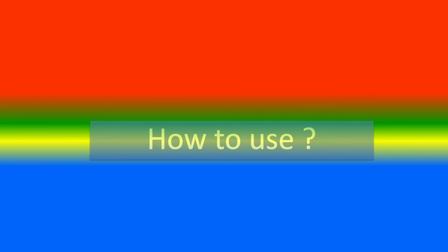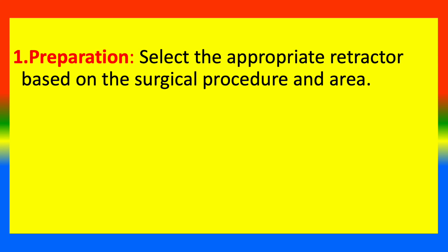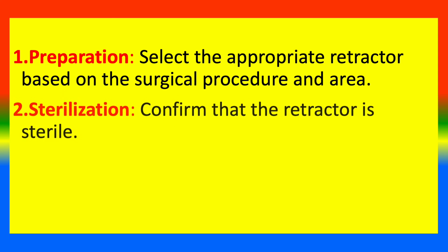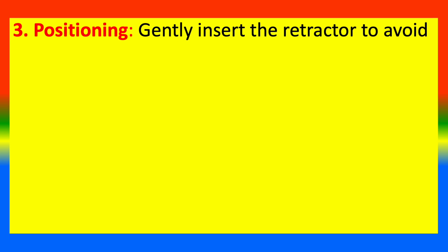How to use the retractors? 1. Preparation. Select the appropriate retractor based on surgical procedure and area. 2. Sterilization. Confirm that the retractor is sterile. 3.